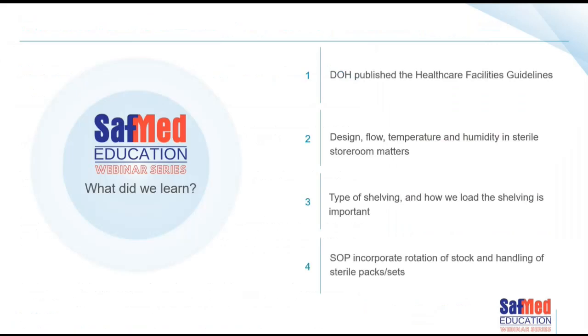So, starting to summarize, what have we learned today? We've covered quite a bit of information. Some of it you know, some of it you remember, and some of it you've been reminded about. It's important to note that the Department of Health has published the Healthcare Facilities Guidelines, and we should be storing our packs in a manner that is in line with what the Department of Health says for our country.